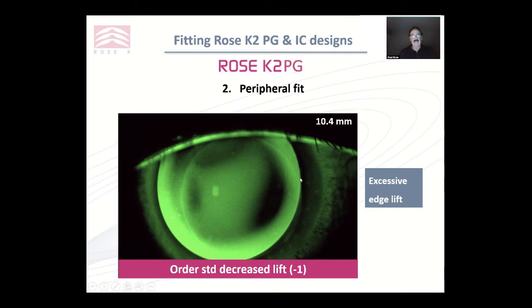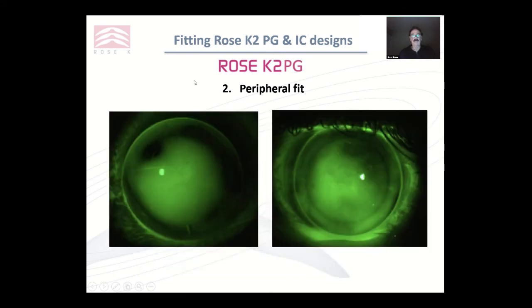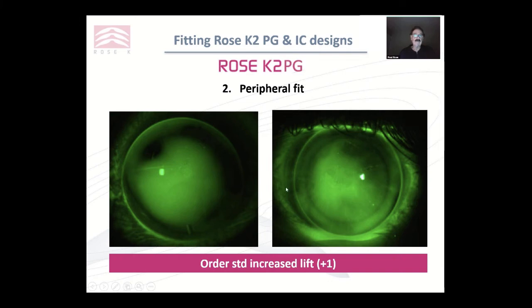This one is getting excessive — over a millimetre — which would make the lens a lot more mobile. You can see it is tending to mislocate out into the temporal portion. So here you'd want to order a decreased lift. Both of these are too tight in the periphery. If you see that black edge, this indicates the edge lift is too tight. You would need to increase it. The standard plus one would give a nice result, resulting in an edge lift like you can see in this part of the lens.